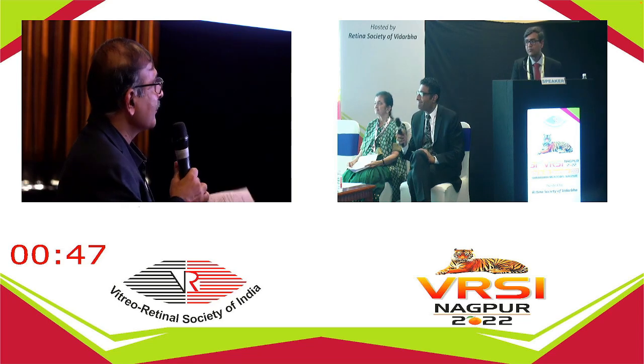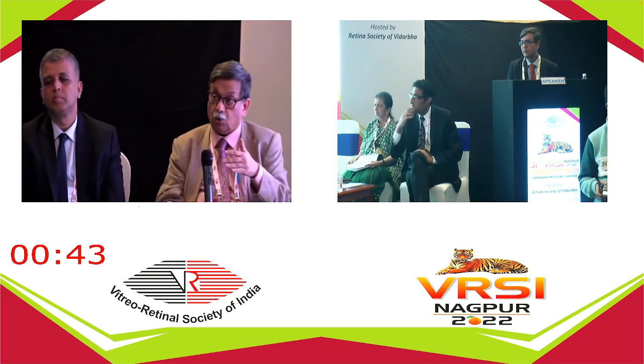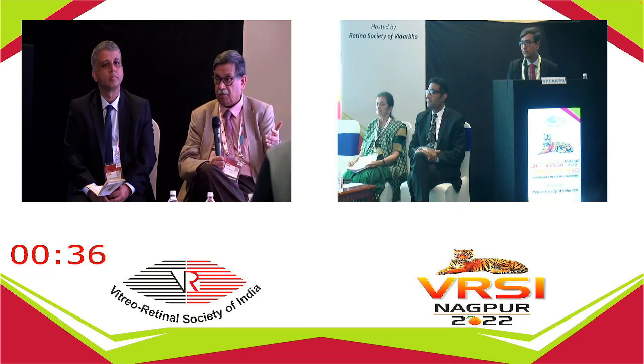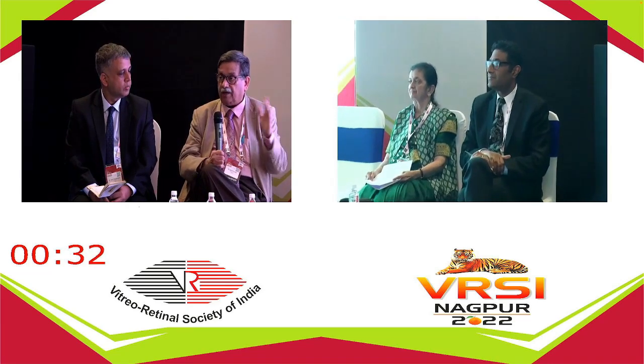Right. Avinash, do you believe the safety would be higher with a TTT with ICG versus a thermal laser? Because effectively, you're using the TTT as a thermal laser when you use ICG with it. It's nowhere related to what PDT is. PDT is activation of the dye. Here, there's no activation of the dye. Here, the dye is actually concentrating the heat for you. So if it's concentrating the heat, it's actually a thermal laser. It's not a photochemical laser.